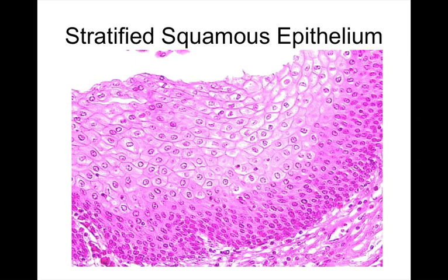So now, free space up to the top again. Talk to me about this kind of epithelium. How do you identify it? So this is stratified squamous epithelia, and a characteristic that I look for is that it's usually resting on top of layers of cuboidal cells, which I think you can clearly see here. And it's the same flat scale-like structure that you look for. There are just many layers of it. Right. So, as always, we name the tissue type based on what it looks like at the apical face. But yeah, they start off being kind of bunched together.